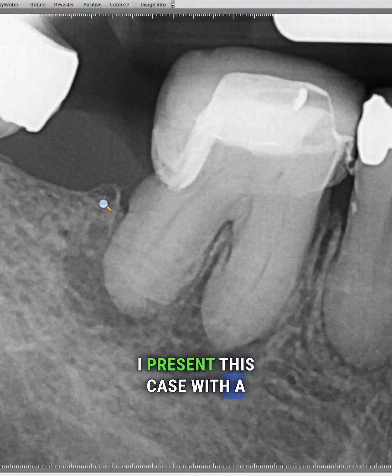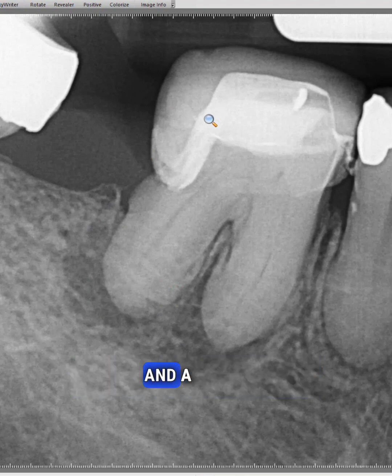I present this case with a lot of humbleness, astonishment, and a lot of grace. As you can see, tooth number 30, the core is very close to the distal canal, with quite a significant apical lesion on both mesial and distal roots.